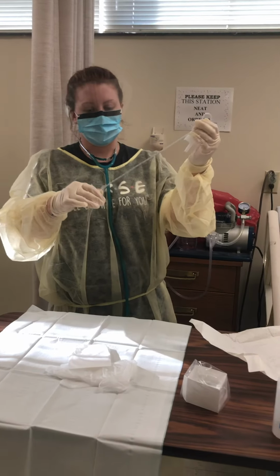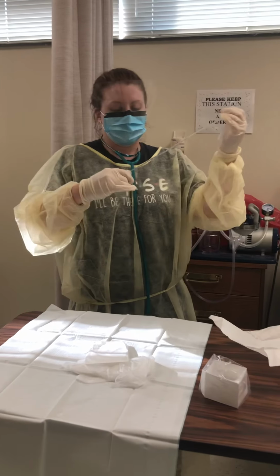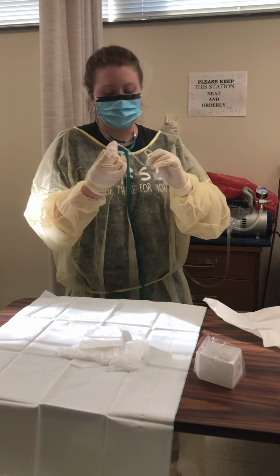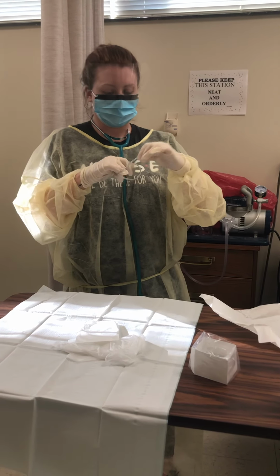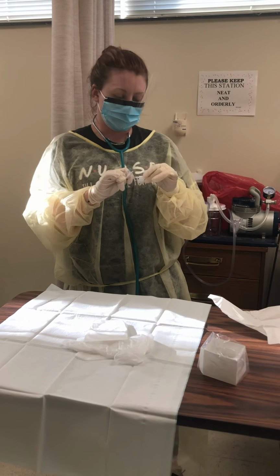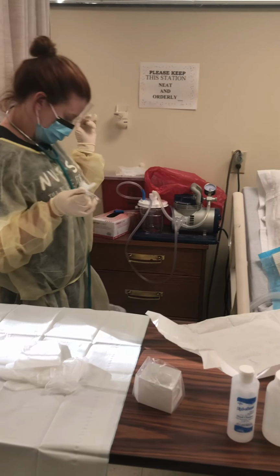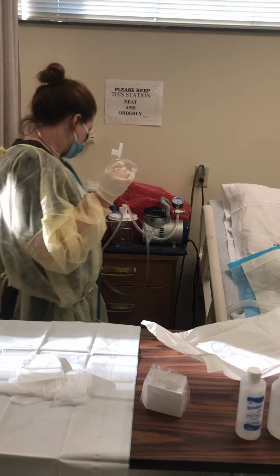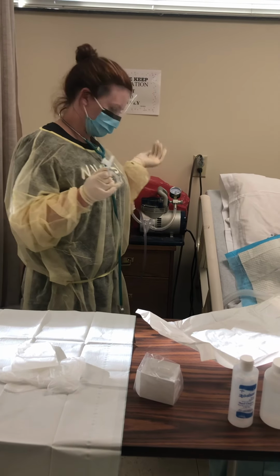And I'm going to wrap it around my dominant hand. And I'm going to come over here and attach it to my suction and turn my suction on. And then my left hand will become unsterile.